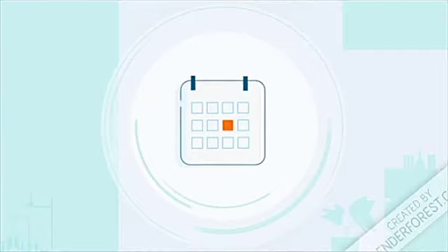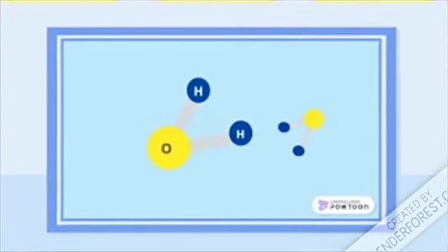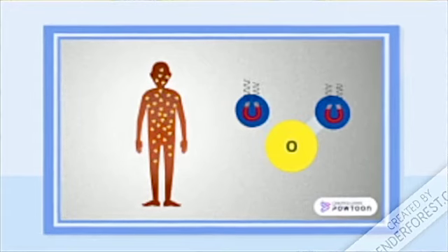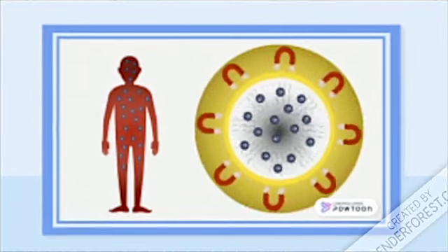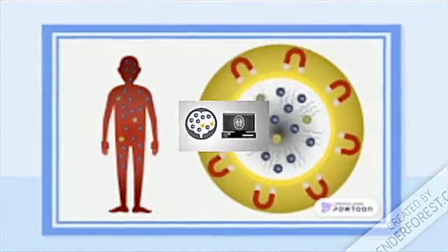Through the advancements in the research and the clinical application of magnetic resonance technology, we have achieved an increased knowledge based on its functionality. MRI scanners employ powerful magnets that force protons to align with the magnetic field. Essentially, hydrogen protons in water molecules spin on their axis, giving them a magnetic moment, which in turn magnetizes the water molecules of the body. Thereby, when the body gets exposed to a large magnetic field, the water molecules line up and spin at a specific frequency. Additionally, a secondary magnetic field turns and repositions the water molecules. But when this field turns off, the molecules begin to realign, and as they align, their frequency changes.